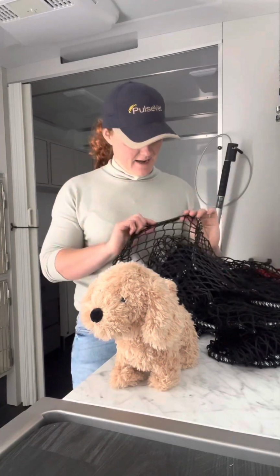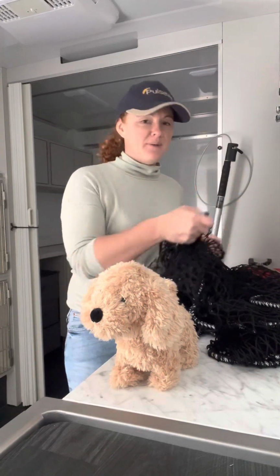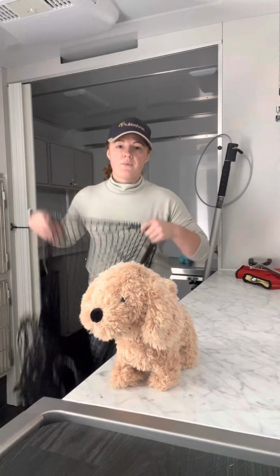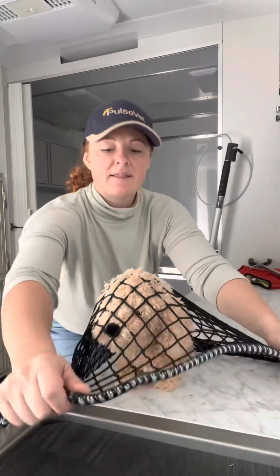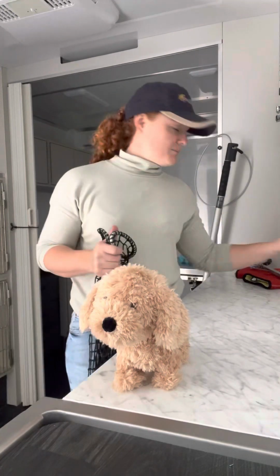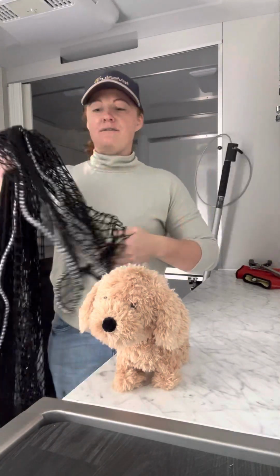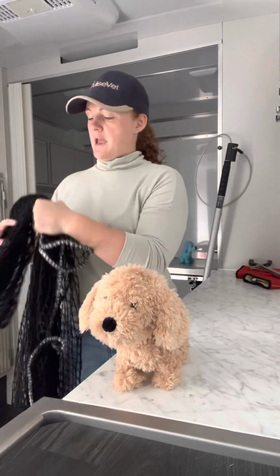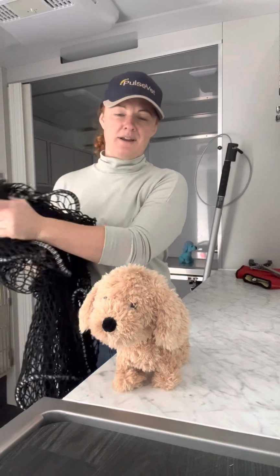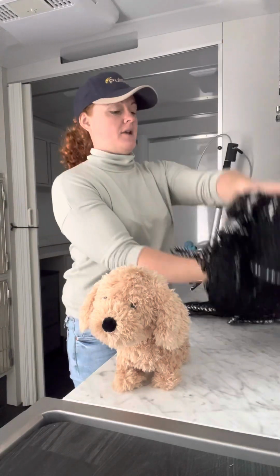This is the catching net. So again, this is an MDC special. It's slightly weighted around the edge, and it means you can stand quite far away from an animal and you can throw it over them, and it will land across them like this. It's weighted so it'll stay down on the ground, and then you're able to get up to them, possibly with your gauntlet gloves, wrap them up in that net, give them the injection to be able to anaesthetize them, bring them into the clinic. So really great for scatty cats that you can't get too close to, or animals trapped in the rubble, such things.